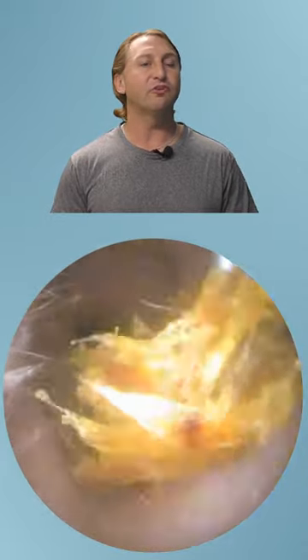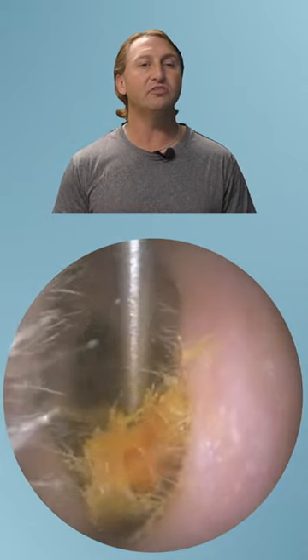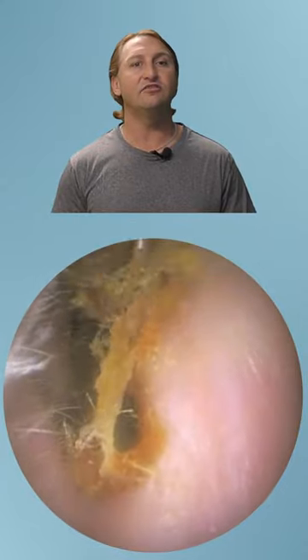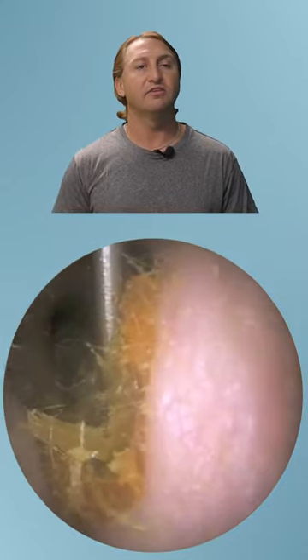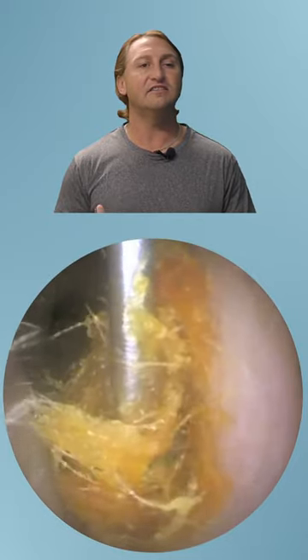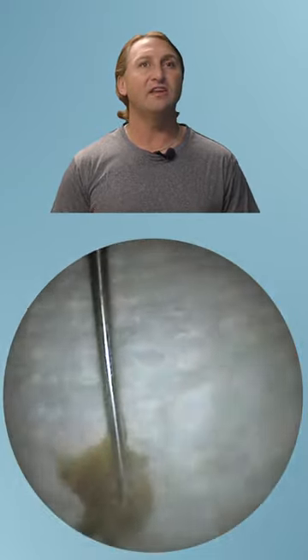As we remove this first chunk, let's take a look and see what comes out of the ear. It's a nice sized chunk there. It's a little bit lighter in coloration. You can see how it's kind of getting stuck as we pull it out. There's what came out of the ear.